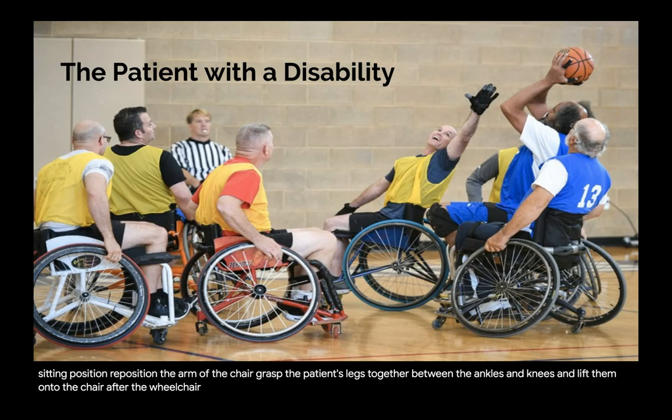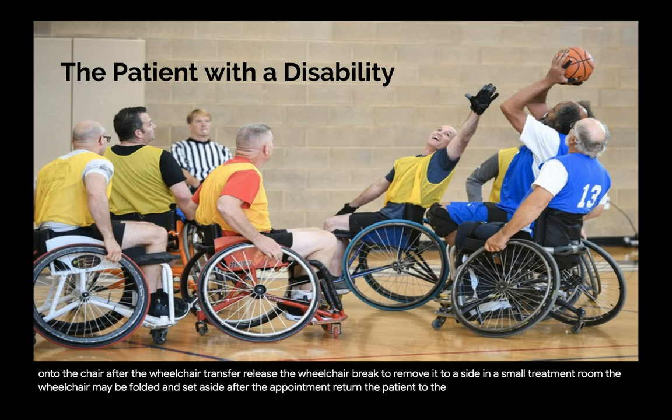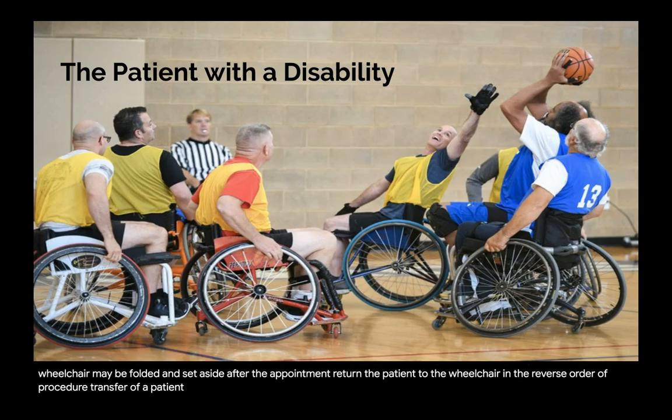After the wheelchair transfer, release the wheelchair brake to move it to a side. In a small treatment room, the wheelchair may be folded and set aside. After the appointment, return the patient to the wheelchair in the reverse order of the procedure. Transfer of a patient who is immobile.